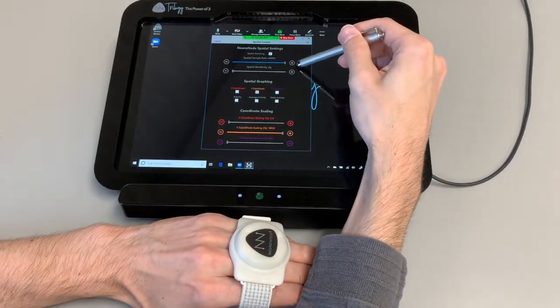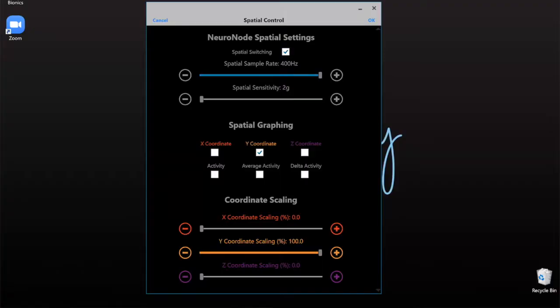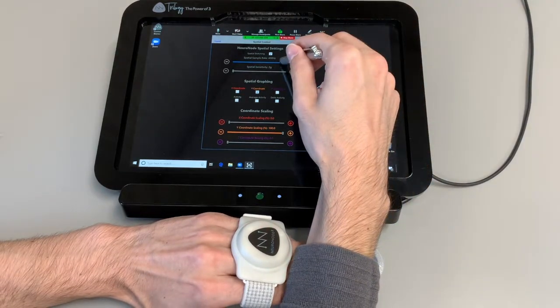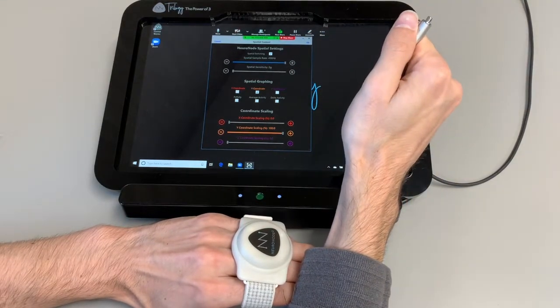Your options up here at the top: the spatial switching being checkmarked just shows that we are no longer using EMG — we're using this spatial movement. Your spatial sample rate: the higher this is, the more the system can refresh and send more data per second, so you're going to be getting more data and therefore it's going to be a little more accurate for each small movement. Keeping this at 400 is going to be your preferred. There are some scenarios where you can set it down to 200, but most likely you're going to be using this 400 hertz.